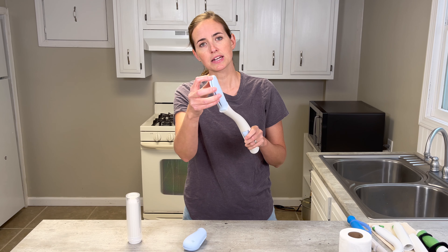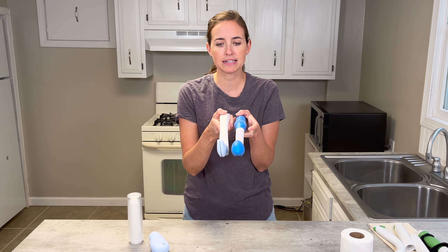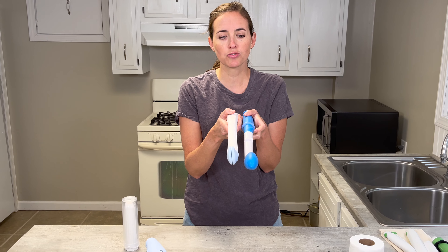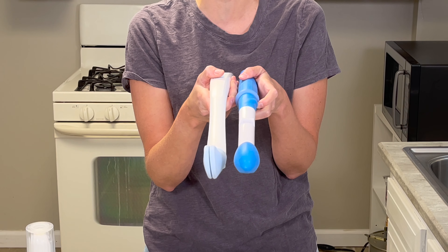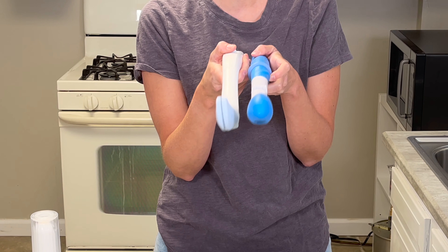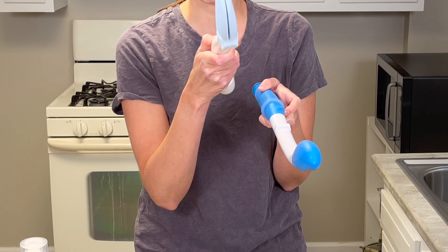This one has a nice flat, narrow head compared to the foldable wand. The Juvo is more narrow, which is a better option if you need to get a little deeper into the crevices to feel fully clean. I would recommend this more paddle-shaped style for that purpose.